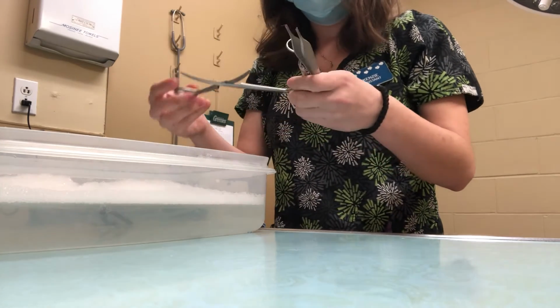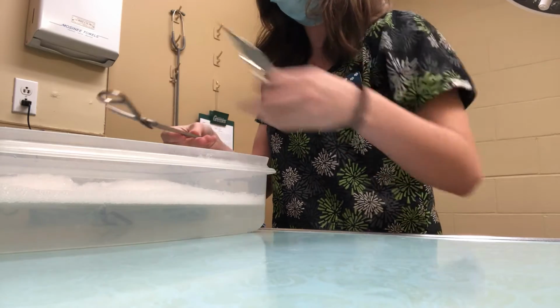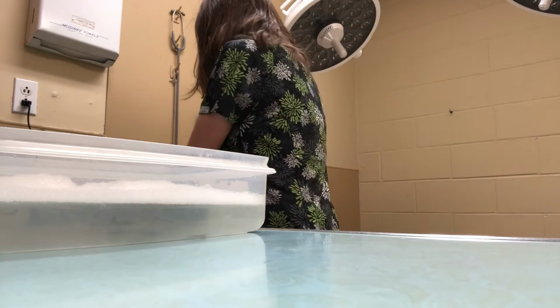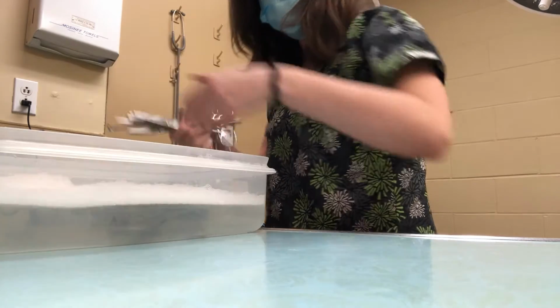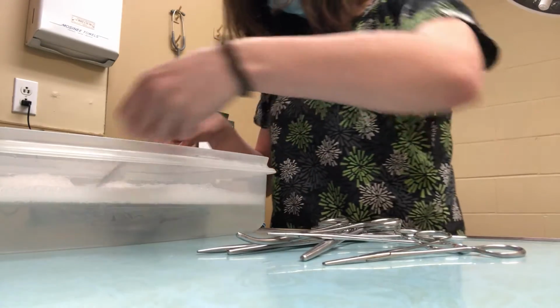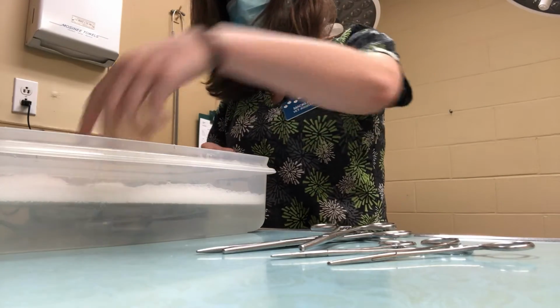And we want to make sure that all of our hinged and box locked instruments are open so that everything is clean. Throw all those in there. And after this, these are going to hang in here for about 15 minutes.